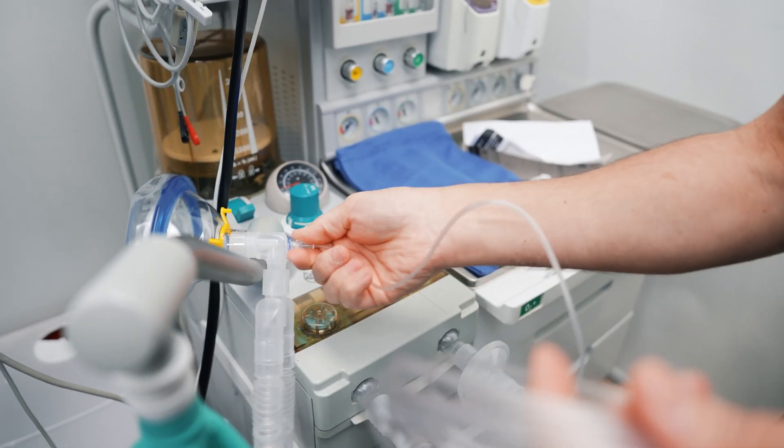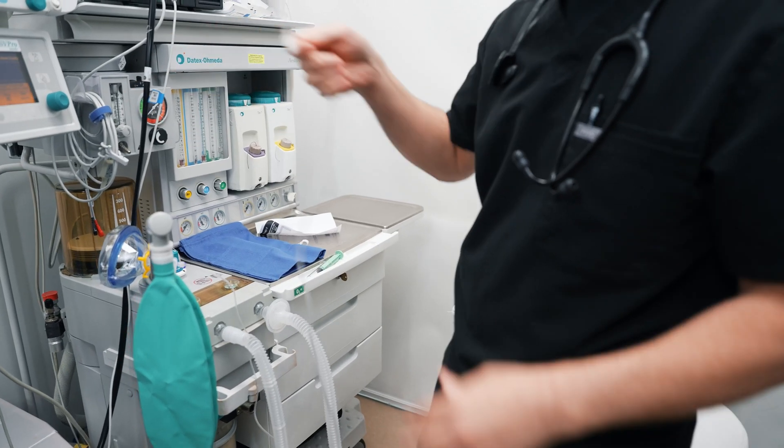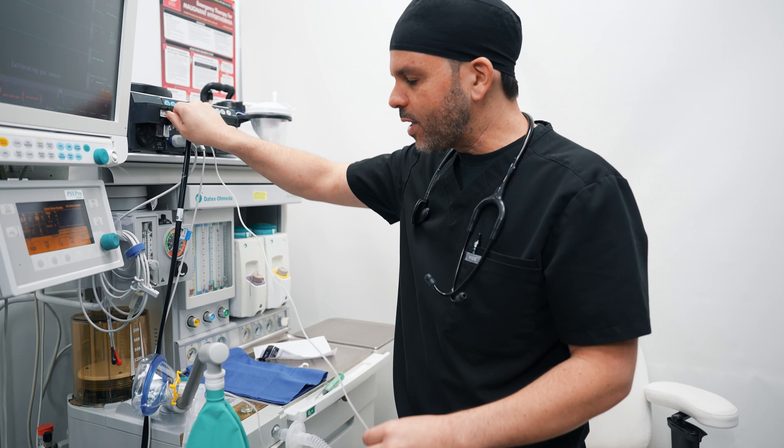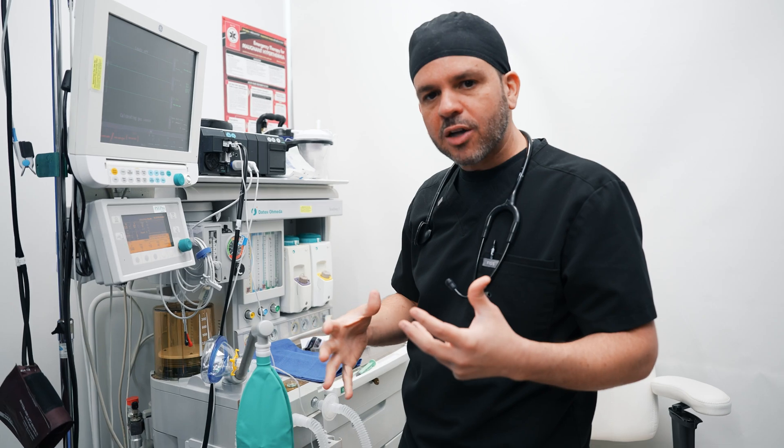This here is my sampling line. The sampling line is going to sample the air that you're blowing out into this machine, and what it's going to do is give me a reading of your CO2. That way I know that you're getting adequate oxygen and also that you're actually perfusing your lungs and your heart during the procedure.